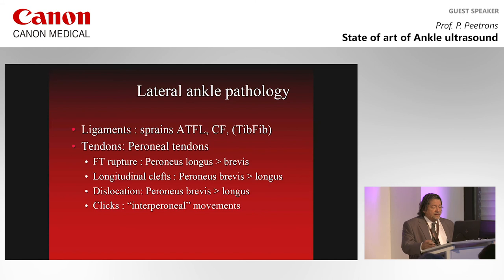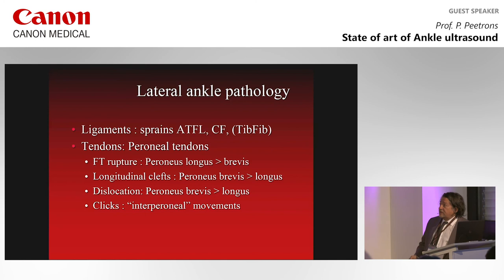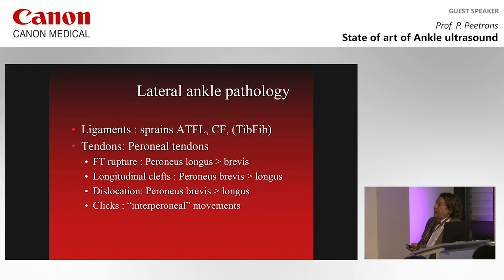So what I will do is give you some new tips, maybe some you know, some you don't know, about ankle sonography and about the ligaments and tendons in the ankle, and also one nerve that we will see. So we'll speak about ligaments, sprains, tendons, and the tendon rupture, peroneal tendons, the rupture, the cleft dislocation, and the clicks. I will show you some videos about that.